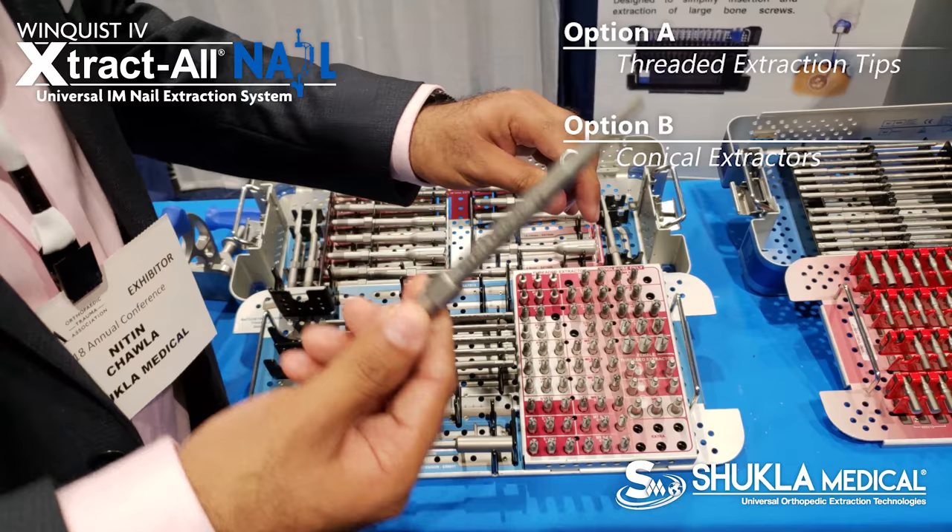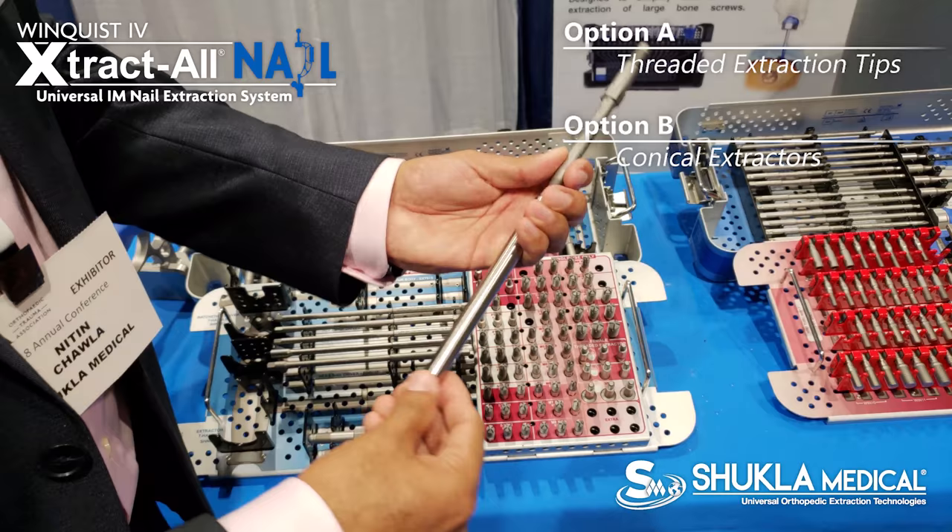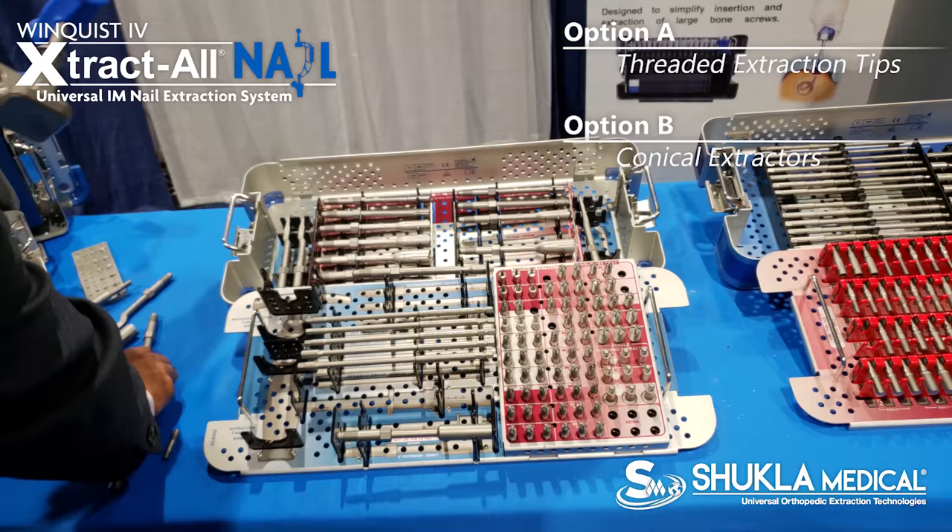In case the threads inside the nail are damaged, you can then use a conical to cross-thread itself into it, and then connect a C-frame and mallet that we offer.